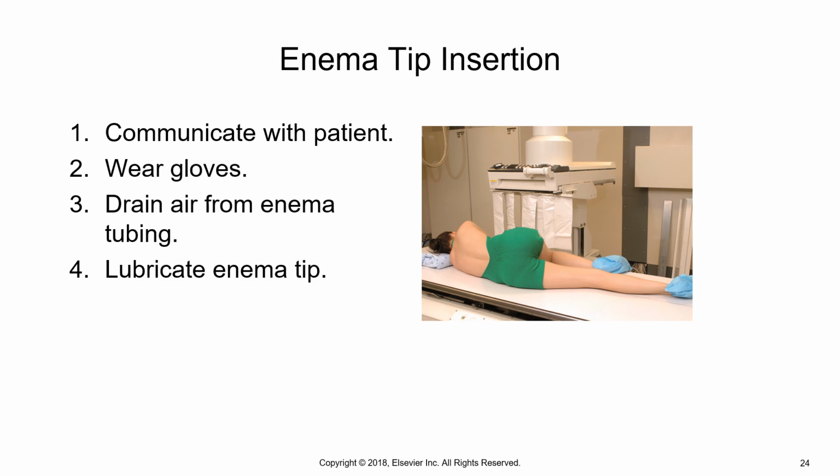So sometimes putting that numbing lubricant like lidocaine on their hemorrhoids before you insert the enema tip feels better for the patient, and you can do that right with the tip. You can just put the lidocaine gel on the tip and then kind of put that over the hemorrhoids with the enema tip. Even if they don't have hemorrhoids, you do have to lubricate the enema tip before you insert it into the patient.